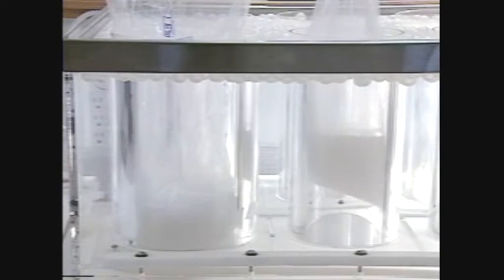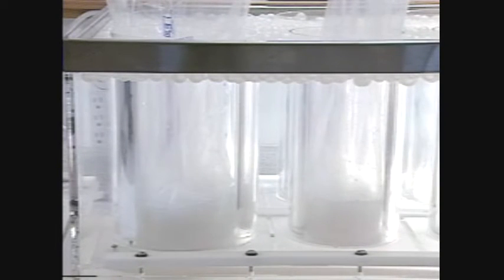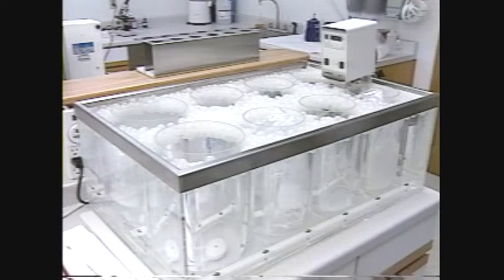The inside of the cylinder is dry, but warmed by the surrounding water. Therefore, the semen will be kept warm, but not temperature shocked, by direct contact with the water. The collection should only remain in the water bath for a few minutes prior to adding extender.